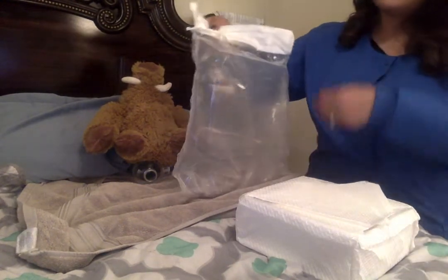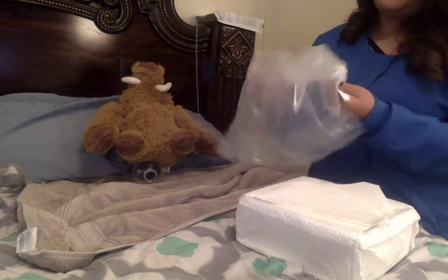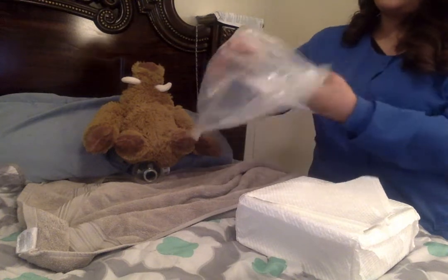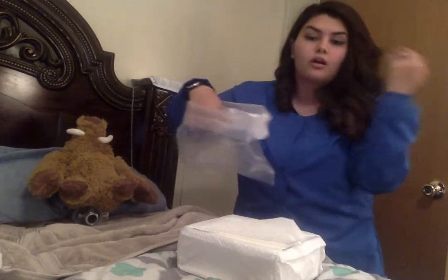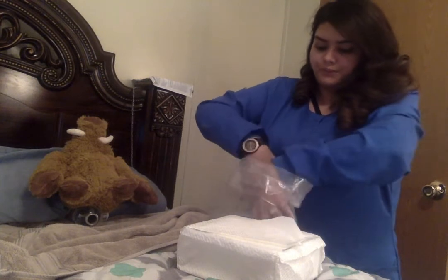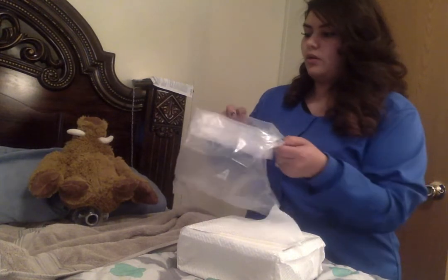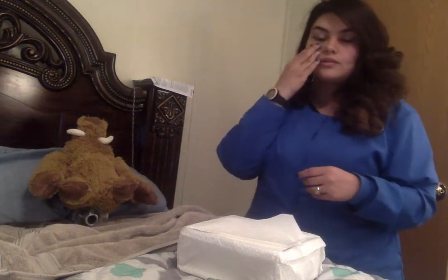What we're going to do with this is turn it into a trash bag so that we don't break our sterile field. Once we've established our sterile field, we want to make sure that we're not breaking it. So I'm going to put this over here so that I can throw my used supplies in it.